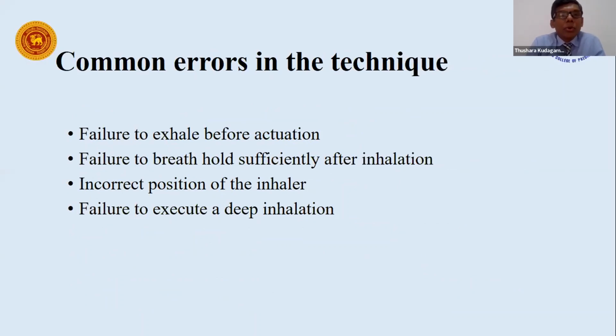The studies have shown that there are common errors in the technique. One of the common ones is a failure to exhale before inhalation, and also failure to breath hold sufficiently after inhalation, in addition to others. So think about these when you advise the patients when you use these spacer devices with them.